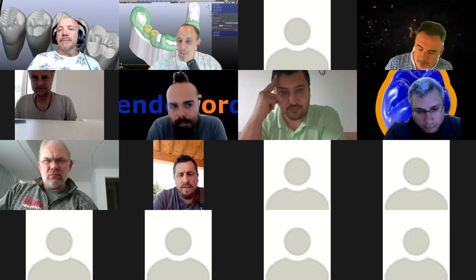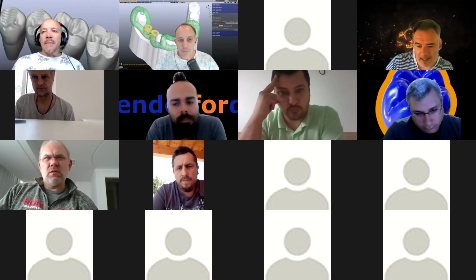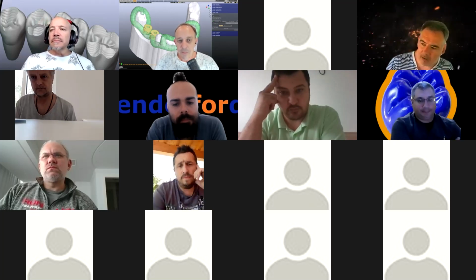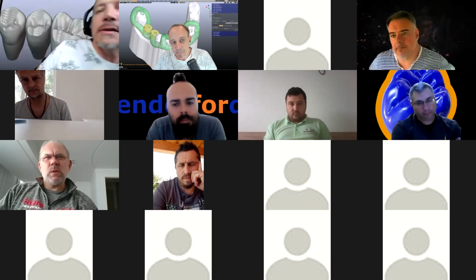Good news. Excellent. All right. Question? One question. Sometimes, because I'm making a lot of mistakes, I go 1 or 3 steps back, and sometimes Blender crashes, and the crashes are often after calculation-intensive steps. And I'm not sure, is this a problem of the scripts or is this a problem of Blender? Yeah, so this is how it works. Like you said, if it's a very complicated script and you go back a step, so you've made a very complicated thing, and you're going back, then sometimes, well, I've actually fixed all the crashes now. So you should not have one crash coming up. So if you update the module, there should not be one crash.